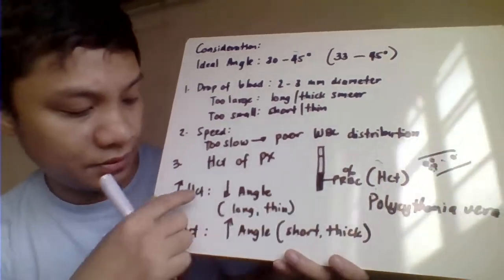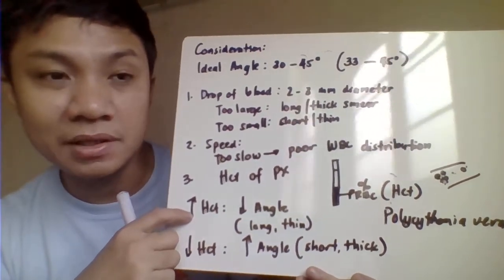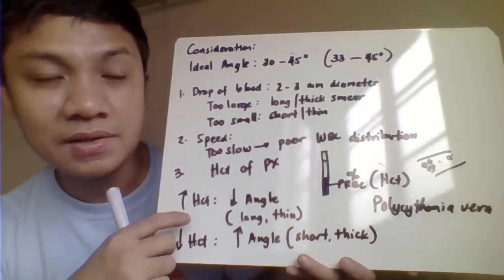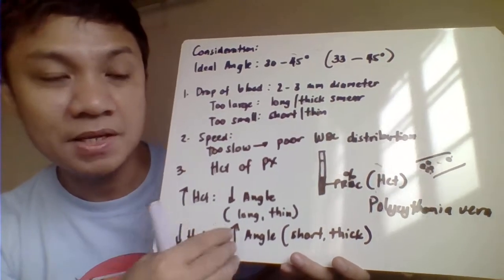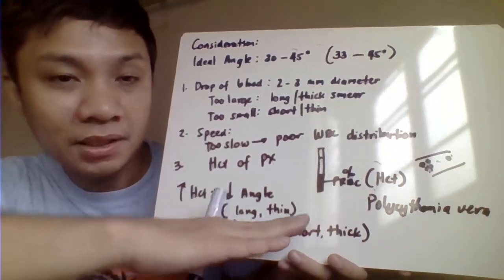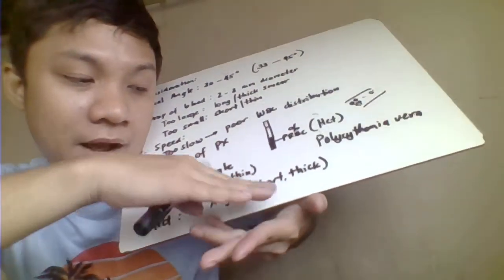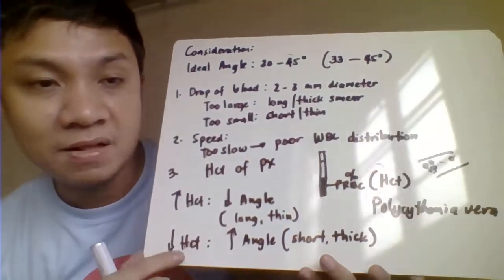So in the case of increased hematocrit, the blood of the patient is very thick. What would be the necessary adjustment in our blood film preparation? Since the blood is very thick because the patient has a high hematocrit concentration, all you need to do is lower the angle. When you lower the angle of the film and push it, what you produce would be a long and thin film.